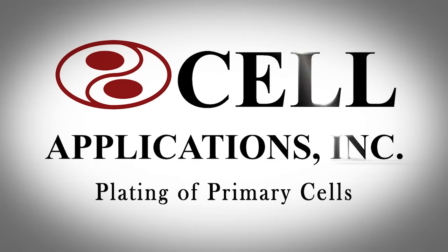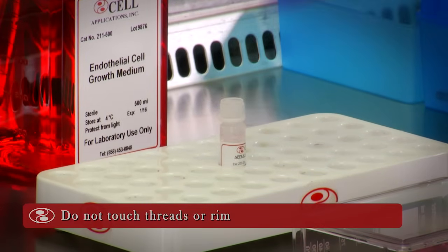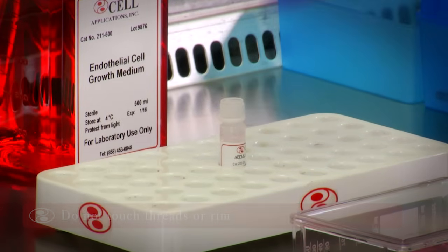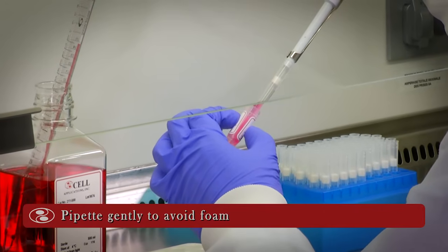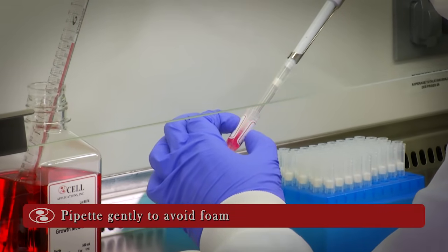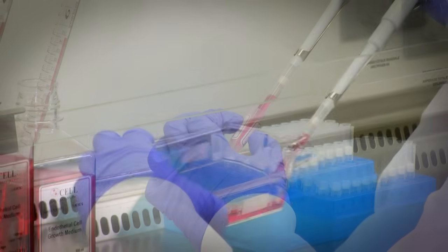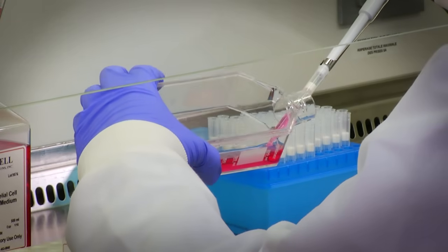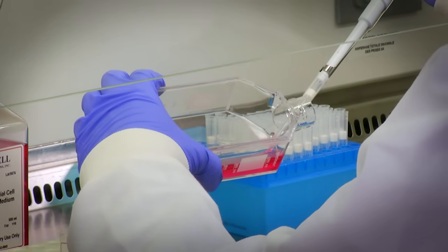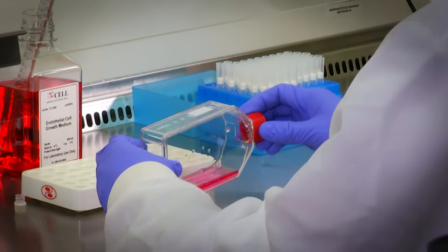Plating of Primary Cells. Remove the vial cap carefully and do not touch the rim of the cap or the vial with your fingers. Re-suspend the cells in the vial by gently pipetting three times with a 1 ml pipet. Be careful not to pipet too vigorously as to cause foaming. Pipet the 1 ml cell suspension from the vial into the T75 flask containing 15 ml of growth medium. Cap the flask and rock gently to evenly distribute the cells.